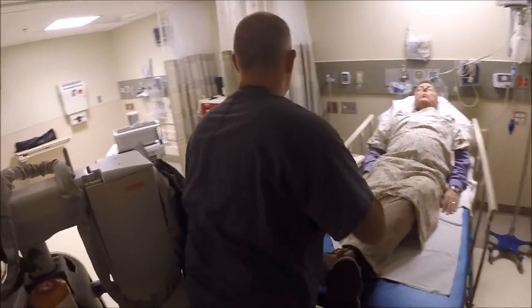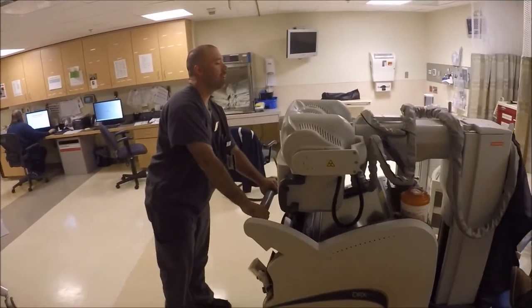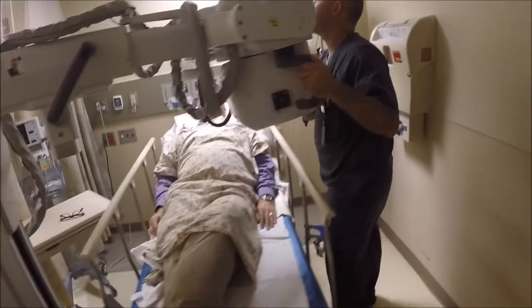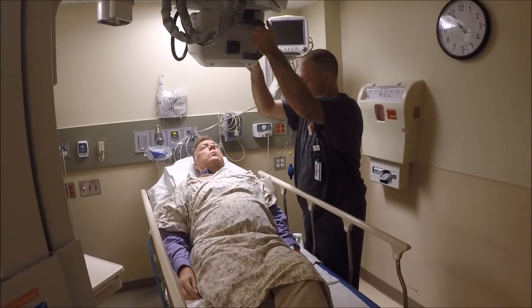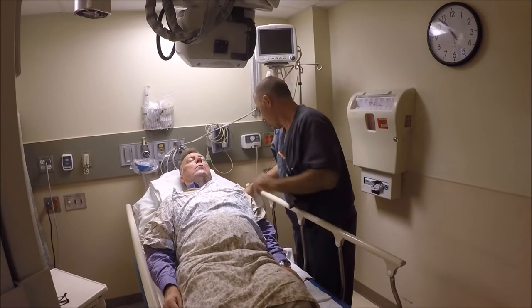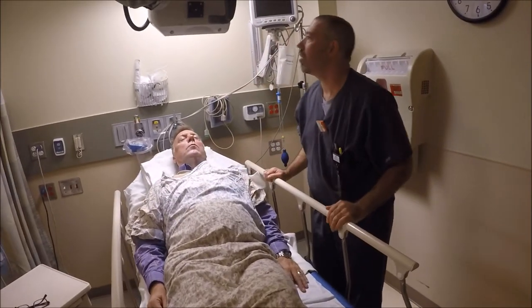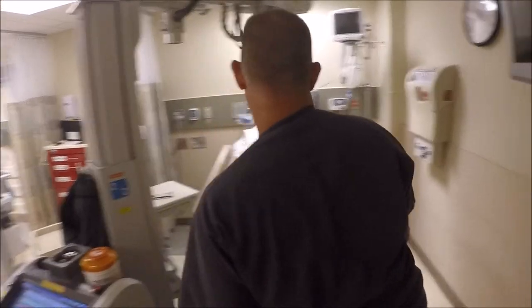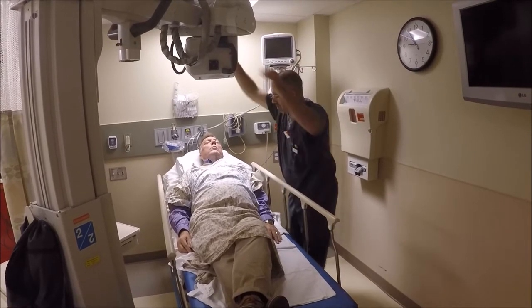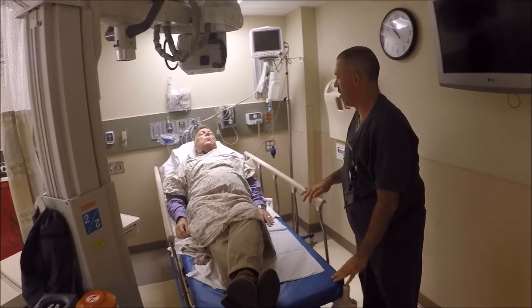I'm going to slide your tray out of the way so I can get the machine in a little closer. I'm bringing the tube over and I'm going to shine a bright light here — watch your eyes. That looks pretty good there. I'm going to check it on this side. A little bit of a tilt — I'm just going to fix that up. That looks a little better. In just a moment, I'm going to give you some breathing instructions for this X-ray. We're just about done.